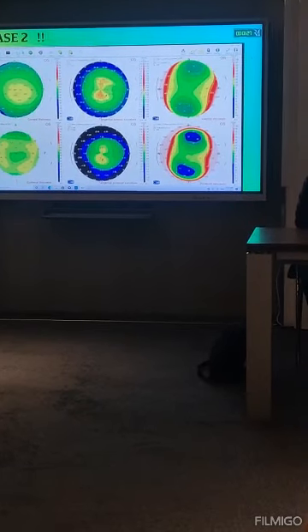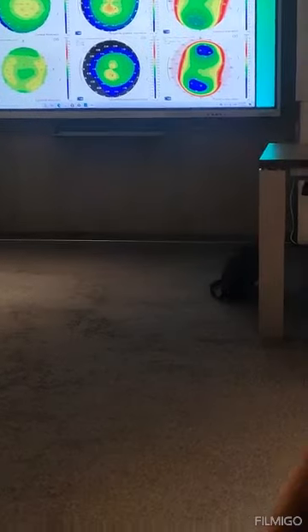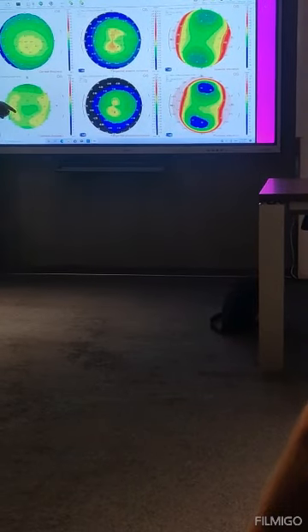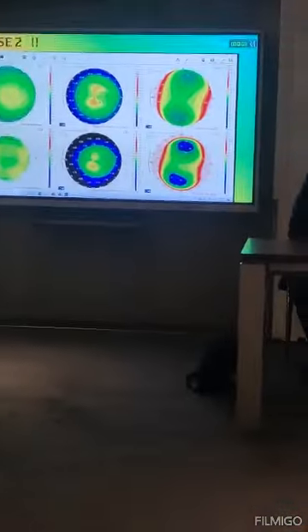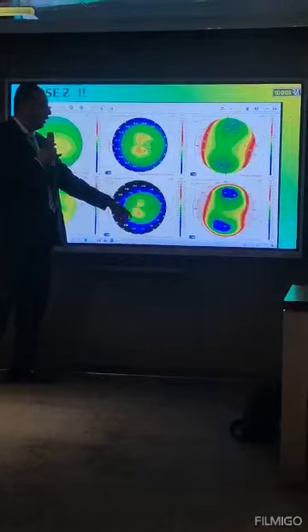The back curvature here is steep inferiorly, right? What about epithelial mapping? If you don't have all these, you can look here. You will find this 61 above and 55 below, so it's going to be thinner than the superior point. The posterior tangential curvature is steep.